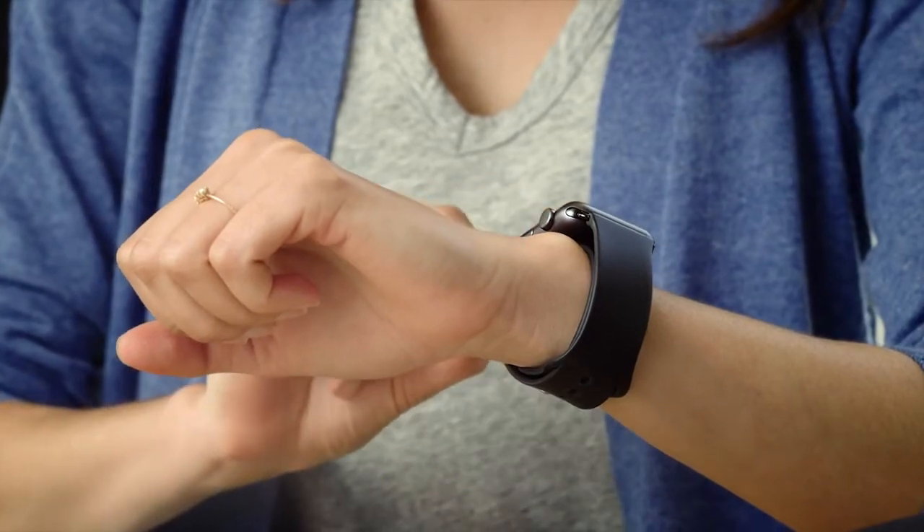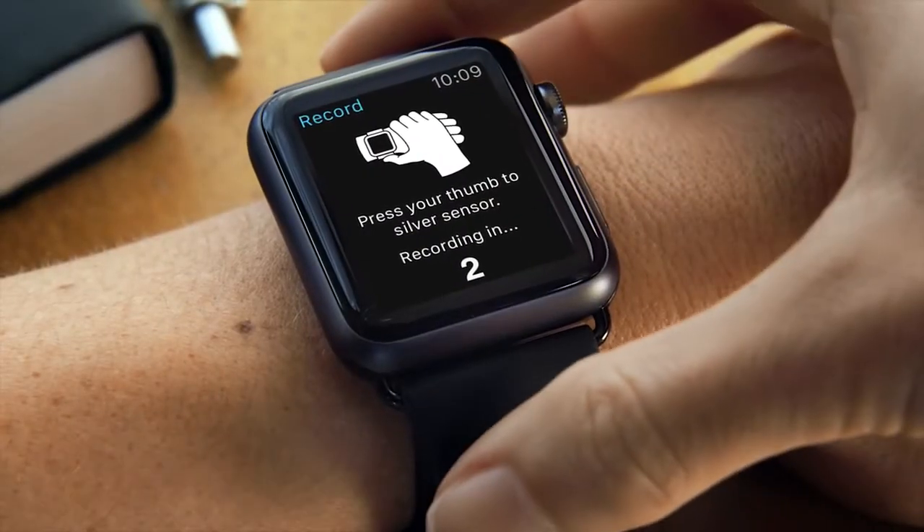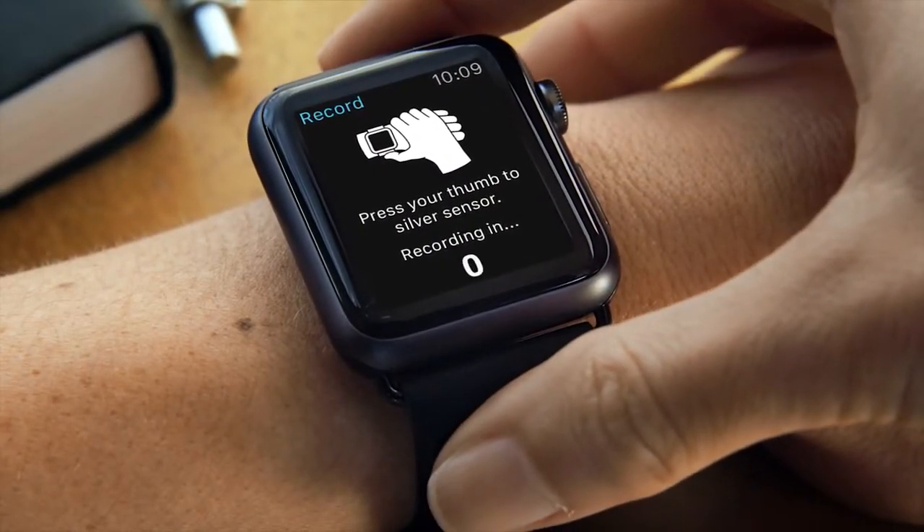Cardia works with your smartphone, tablet, or Apple Watch to give you an accurate EKG in about 30 seconds.